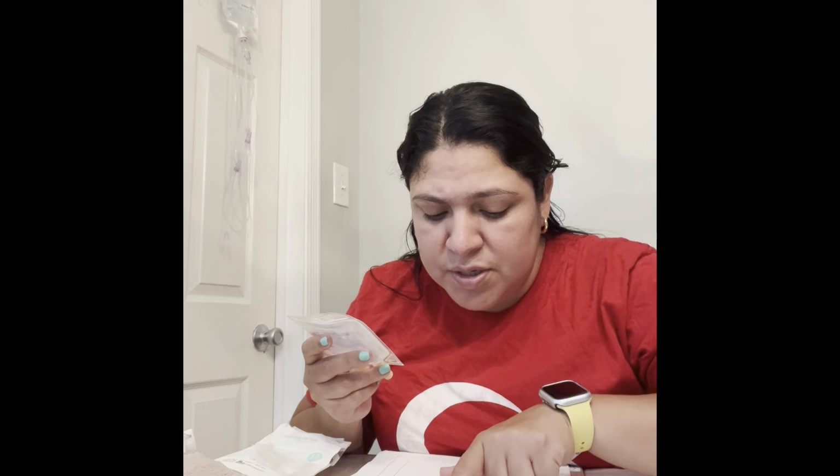I have my tubing, and I have cefazolin sodium, 1 gram in 50 ml. Cefazolin sodium, 1 gram, intravenous piggyback to be given in 50 ml of normal saline over 30 minutes via gravity using 15 drops per ml tubing. Time is now. Doing the math, it is 25 drops per minute. I am going to open the package and check the medication. It doesn't expire until April 2025, there are no particles, it's not cloudy, no puncture. Medication is intact. Time to prepare it.